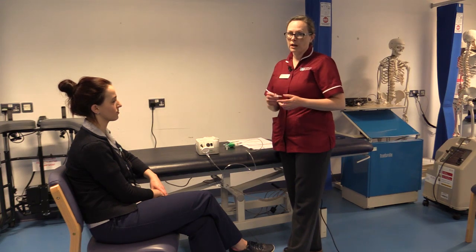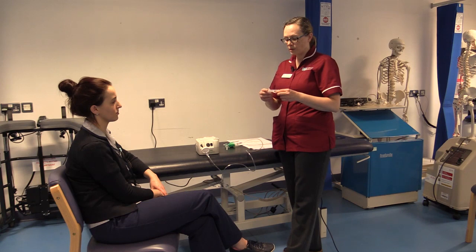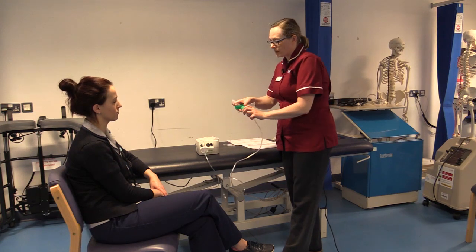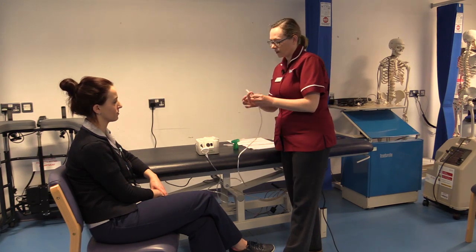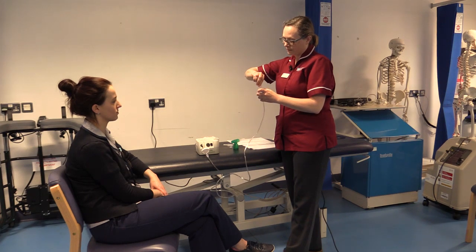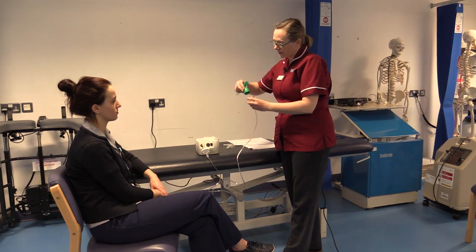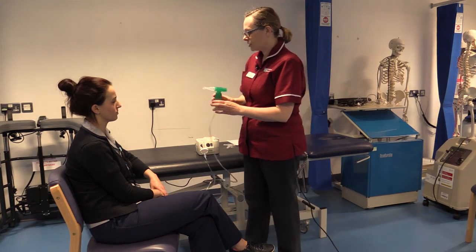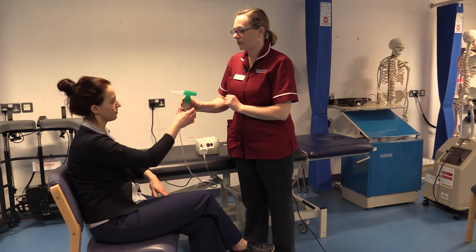You must ensure you have the right patient, the right time, the right route, the right drug and the right dose before you administer the drug. You must also ensure the drug you're administering is not expired, so check your expiry date. So we will take the acorn apart, open the vial and squeeze the drug in. We will then close the acorn and ask the patient to put the mouthpiece between their teeth.